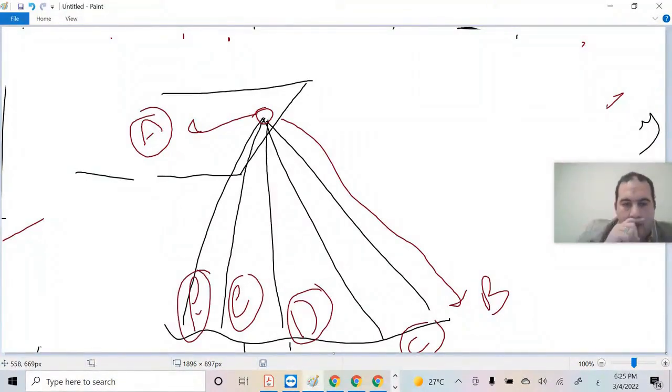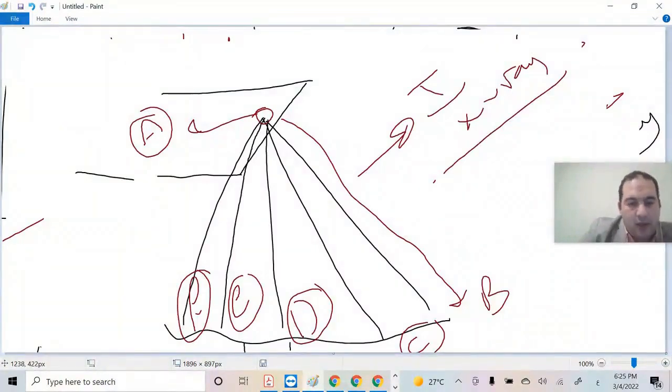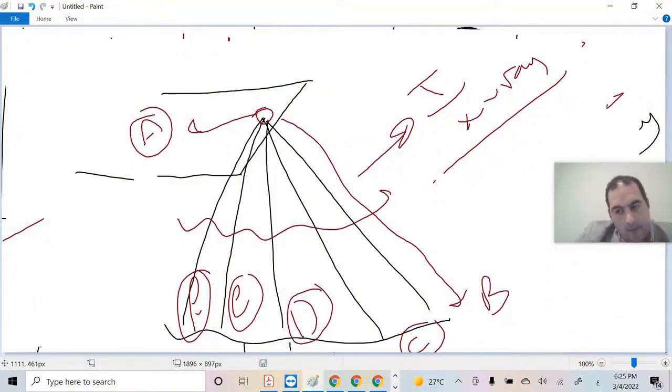Do you expect that from point A to point B, the X-ray intensity is the same as the X-ray intensity between point A and point C, and between point A and point D, and point A and point E? In other words, is the X-ray beam homogeneous, or is there a difference? Is there more difference at point P here? So, which point is higher and which is lower? P has a higher intensity than F, right?